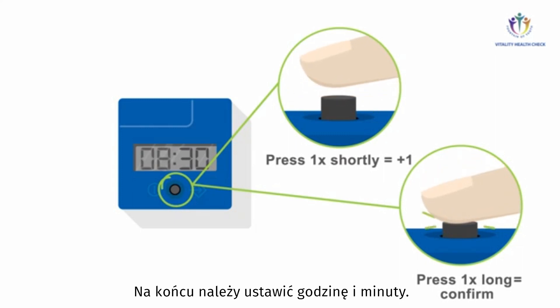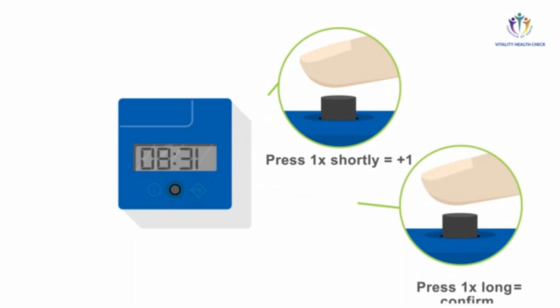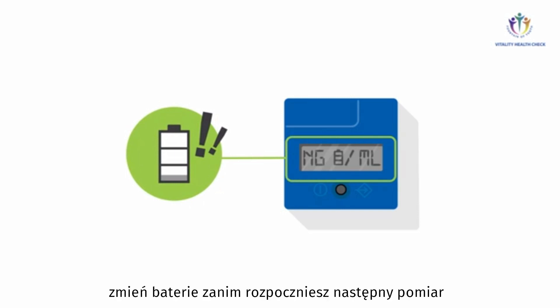Finally, you may set the time: hours and minutes. In case the reader display shows the battery warning icon, change the batteries before starting the next measurement.